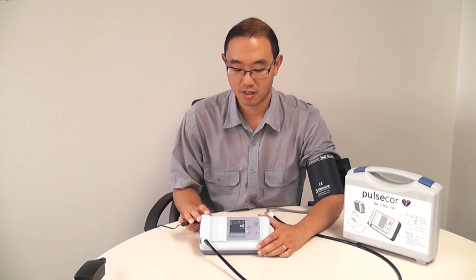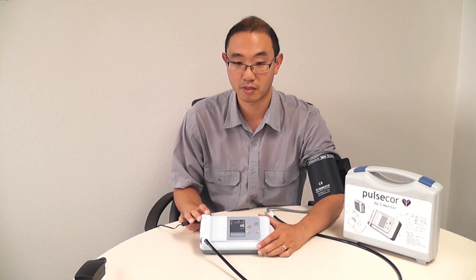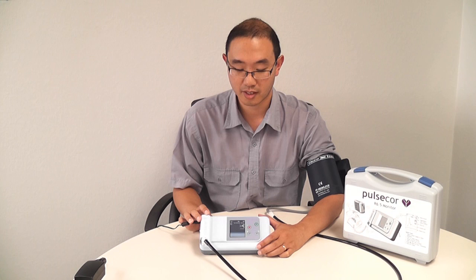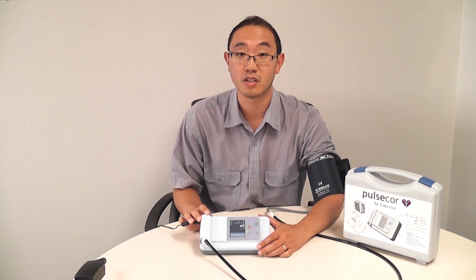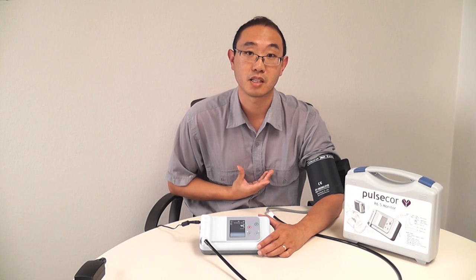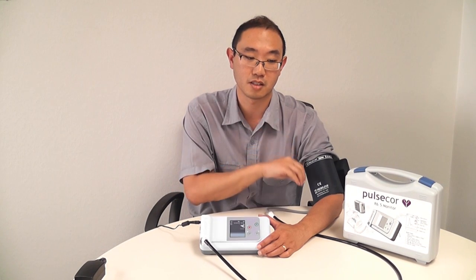After that, it takes another measurement, which we call suprasystolic. It will reinflate the cuff to around 30 mmHg above systolic pressure and hold that for around 12 seconds. During that time, it's listening for echoes within my arterial system. Every time my heart beats, I have a pressure pulse that comes out of my heart and into the cuff.